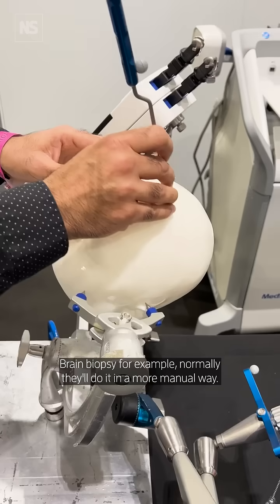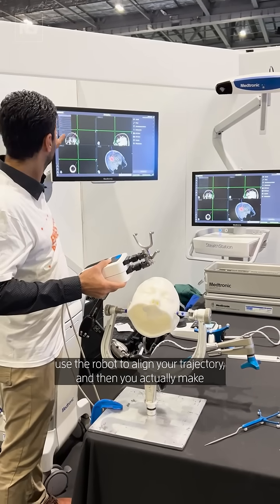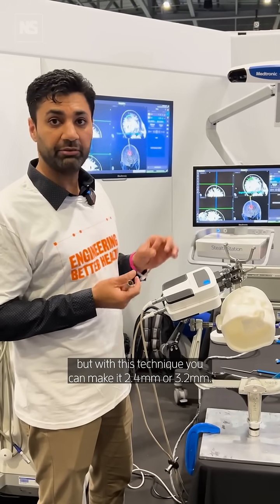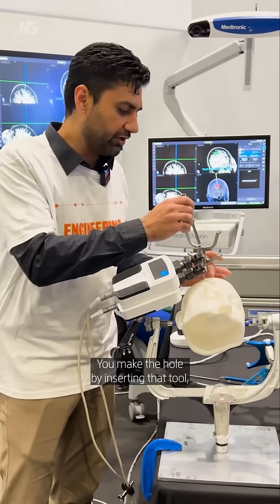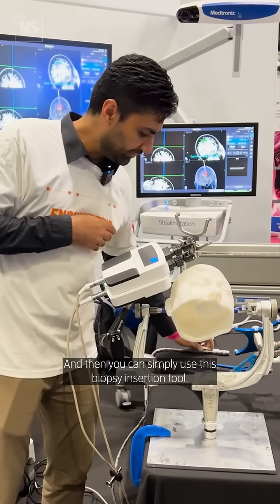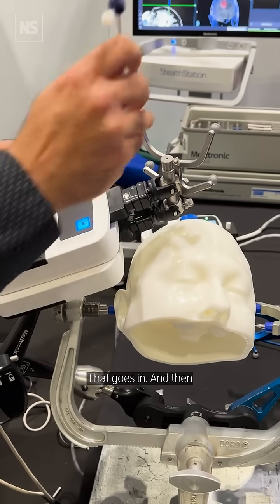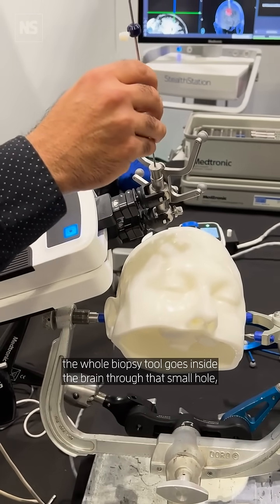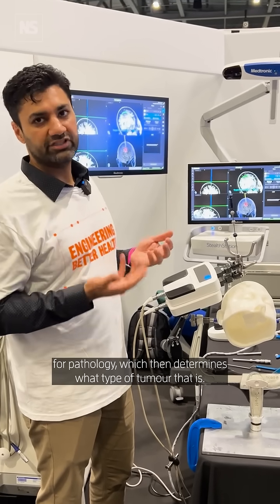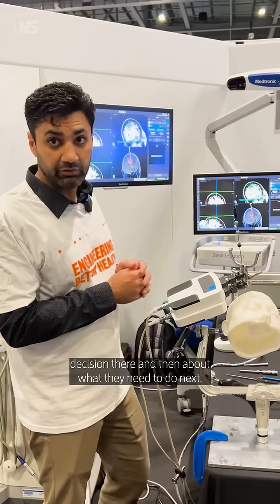Normally they'll do it in a more manual way, but if you had a robot, you'll use the robot to align your trajectory and then you actually make a very small hole. Generally it's between 18 and 20 millimeters, but with this technique you can make it 2.4mm or 3.2mm. You make the hole by inserting that tool and then that comes out. Then you simply use this biopsy incision tool — that goes in, and the whole biopsy tool goes inside the brain through that small hole. You take a sample for biopsy, generally send it back for pathology, which then determines what type of lesion it is. Then they can make a clinical decision right then about what they need next.